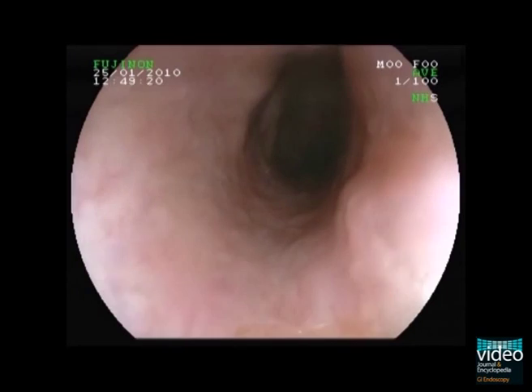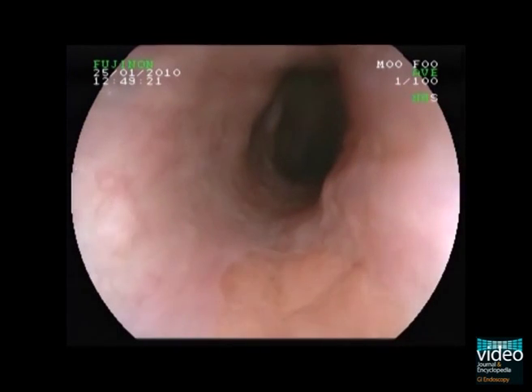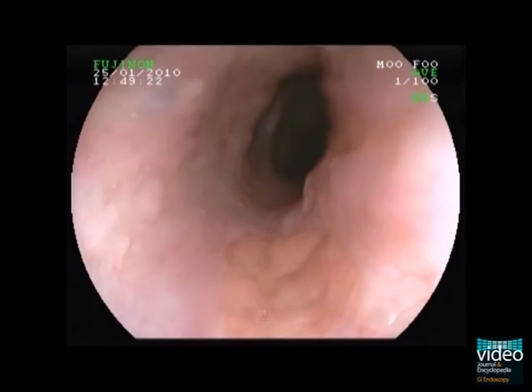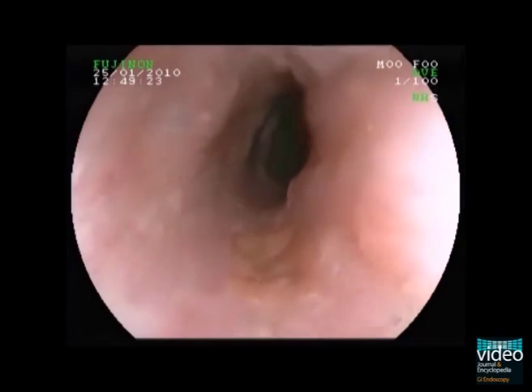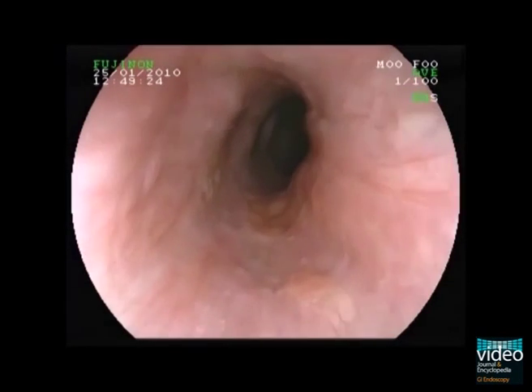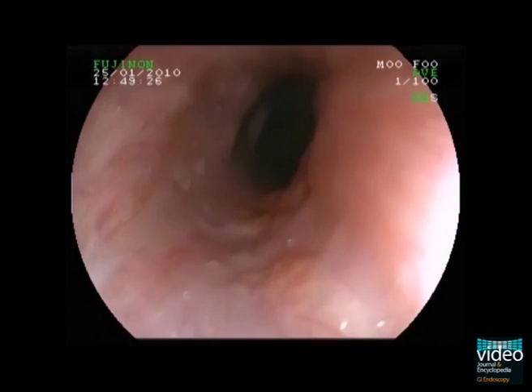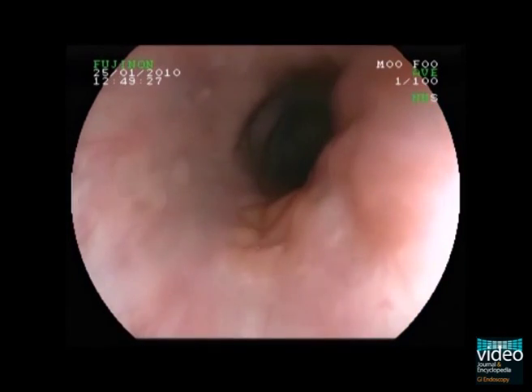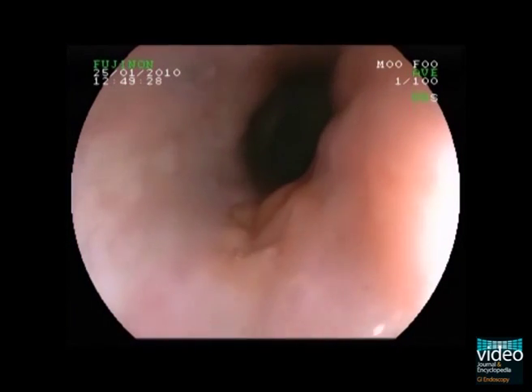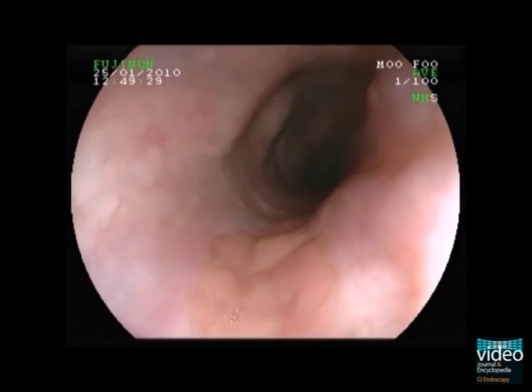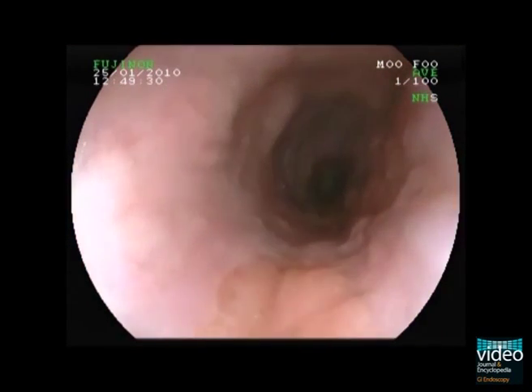This female patient suffers from regurgitation, heartburn, and severe cough. White light endoscopy reveals an island of heterotopic gastric mucosa at the 6 o'clock position.